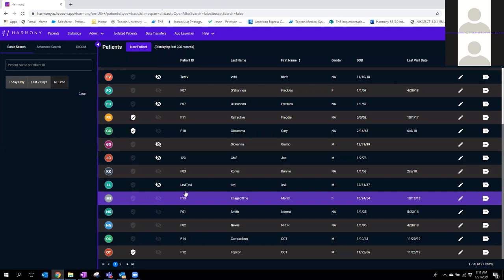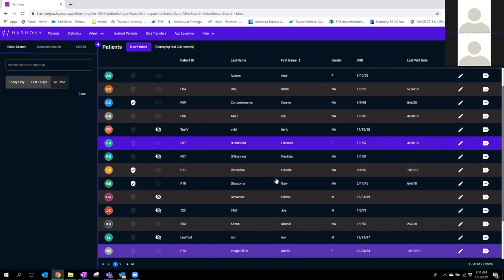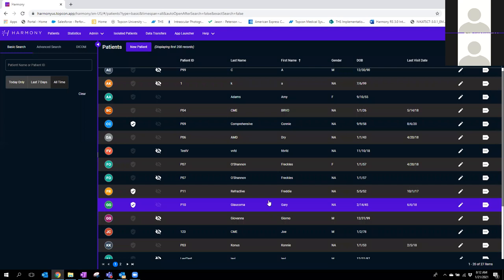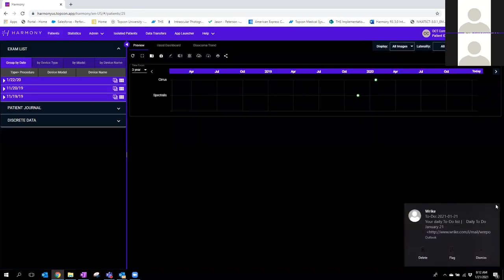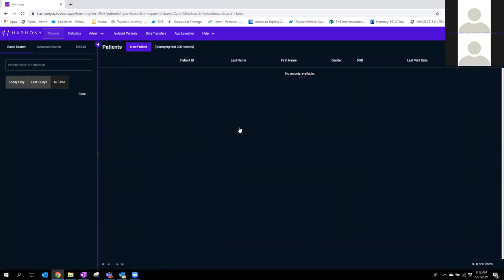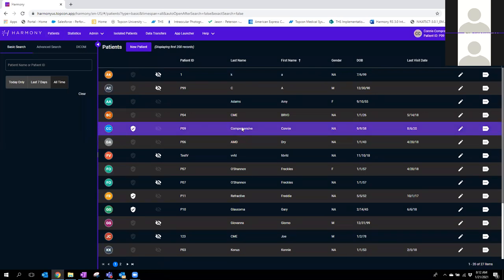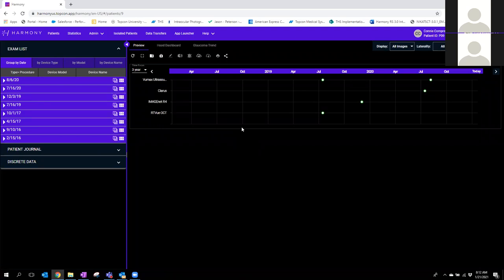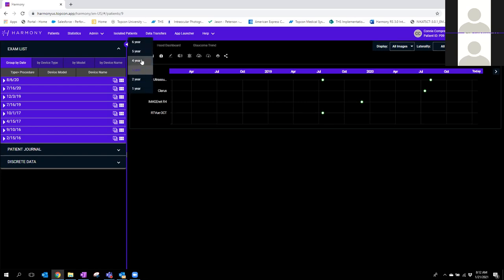I'm going to go into a patient record and train from that one record. When you log into the patient chart, this is what it looks like by default. You know you're in the patient chart by confirming up here. On the right side you have a visual timeline — it says three years. It's a little scarce because it's a sample patient, so there's not a lot of realistic tests. I'm going to change this to a four-year scale. You can scale back as many years as there are exams in Harmony, so if there's a 10 or 15-year history, you can scale accordingly.